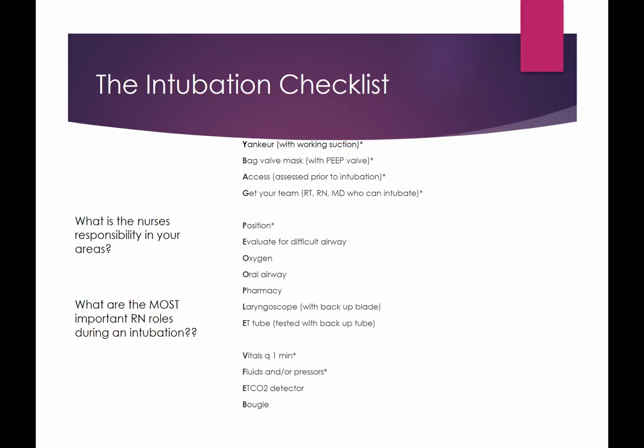And on the flip side of that is when things are not going well, I'm certainly not going to scream at them, their oxygen's 70%, but in a calm tone of, your oxygen is 92%, you're at 86%, your heart rate is dropping, it is now in the 60s, your oxygen level is at 81%, your heart rate is 52, and just really feeding them information so that they know, okay, I need to be thinking of an alternative plan because this patient is not tolerating the procedure at this point.